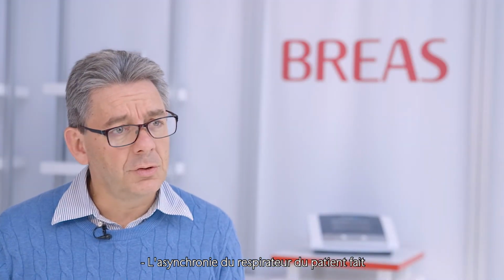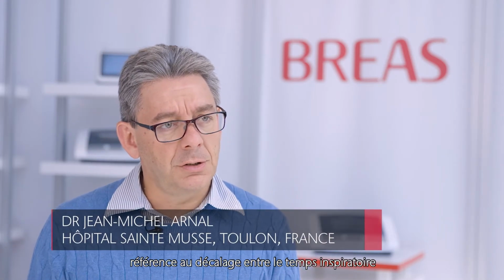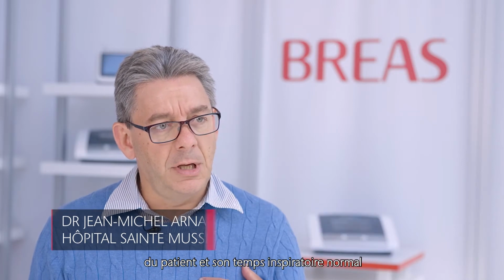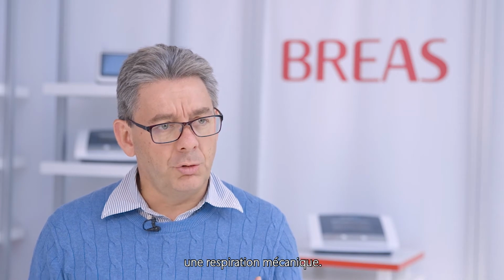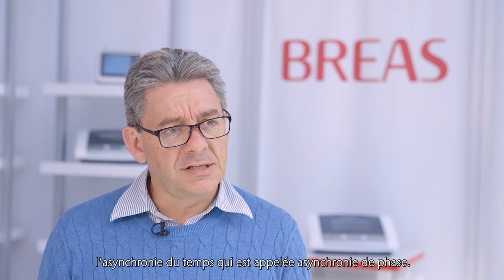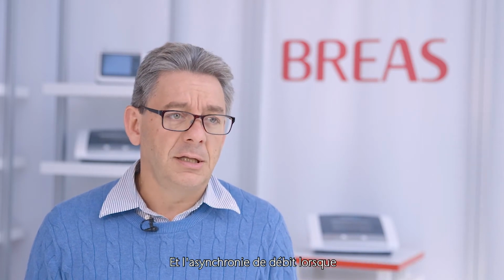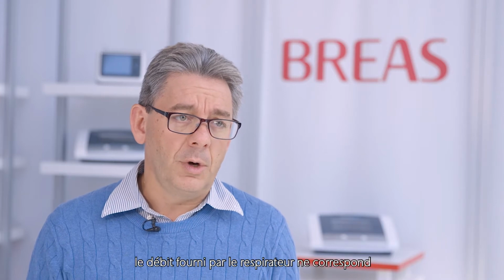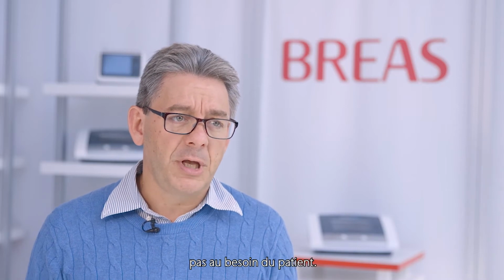Patient ventilator asynchrony refers to a mismatch between the patient's inspiratory time, his neural inspiratory time, and the time of the ventilator, which is a mechanical breath. So there are two types of asynchrony: asynchrony of the time, which is called phase asynchrony, and asynchrony in flow, when the flow provided by the ventilator does not correspond to the need of the patient.